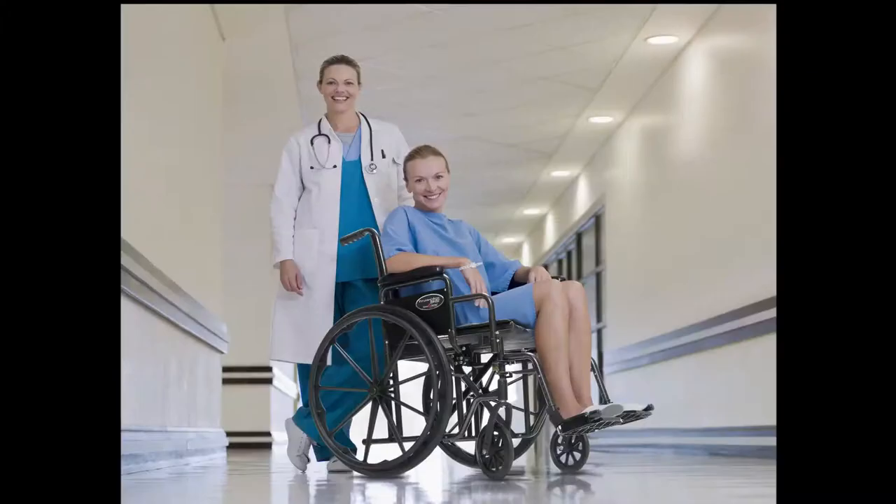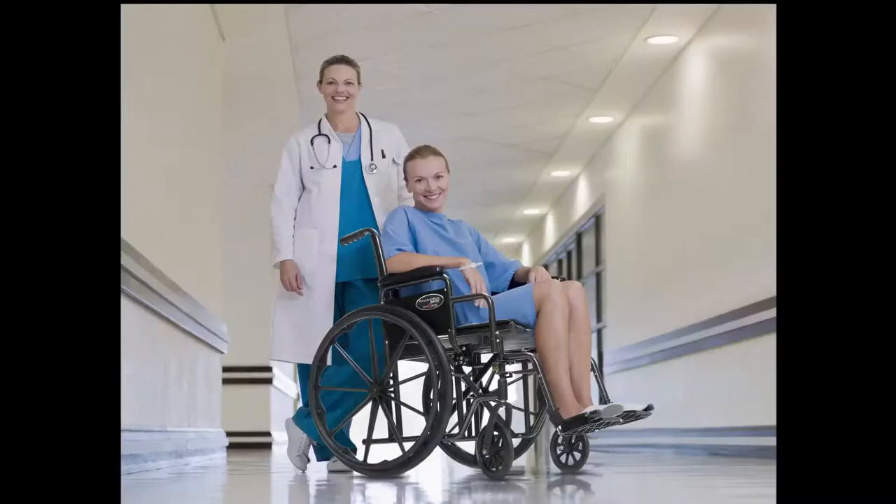Our wheelchairs reflect the commitment to quality, durability, efficiency, and patient comfort as a signature of our work. Graham Field for a better quality of life.